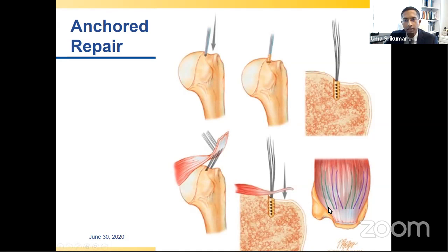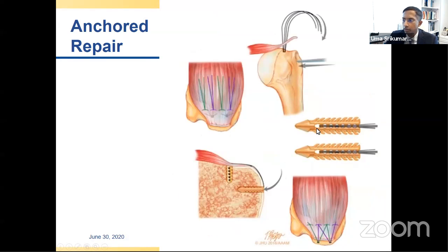We'll also discuss later some of the advantages and disadvantages of that. And perhaps too many of these suture knots on the medial row can lead to a stress riser or cause an unfavorable recurrent tear pattern, or type 2 muscle tendon junction tear. But you have these options to tie them medially or bring them into the lateral row, these same sutures being brought into a pilot hole for a lateral anchor. And this achieves our final construct, which has two rows of anchors with the sutures connected from the medial row brought into the lateral row. So this is why it's referred to as a transosseous equivalent. You can see almost a fully transosseous connection, not quite, but done via anchors. And then the way and number of ties medially can be varied, and how you position the sutures is per surgeon preference. Many different techniques have been described.